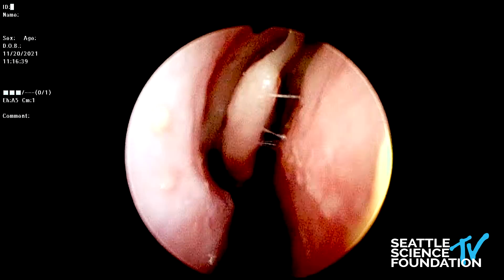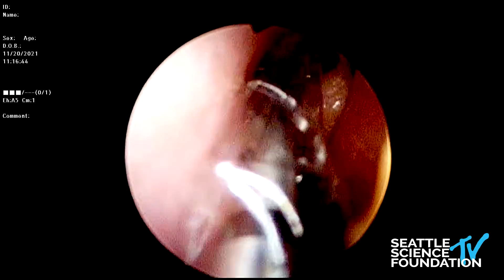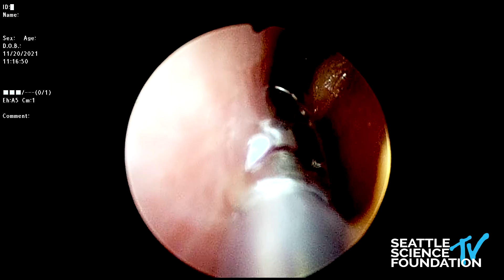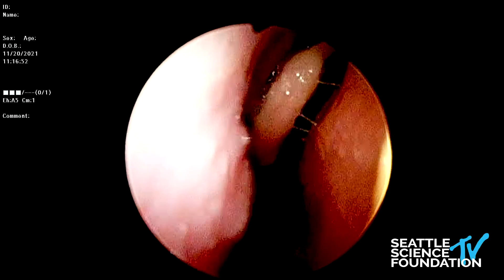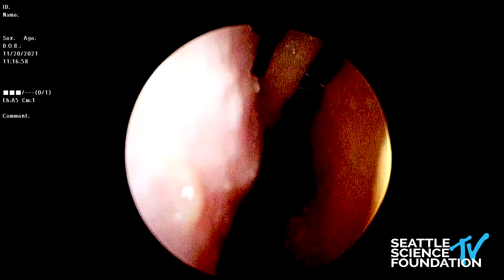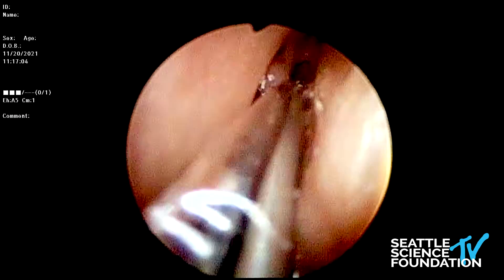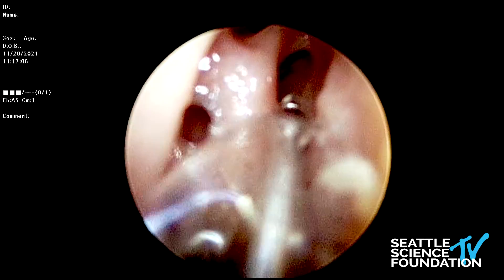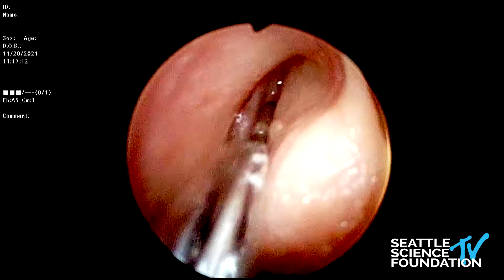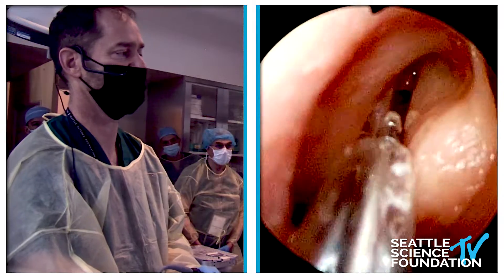Where's the frontal? So if we look at where we are on the nav — do you have us plugged in there? As you can see, the red crosshair is on the nav, meaning we are not — there we go, it's green — and the question is, will it pick up? One key when I'm doing this: just as the posterior belly of the digastric is known as the resident friend, I call the middle turbinate the resident friend for frontal sinus surgery.